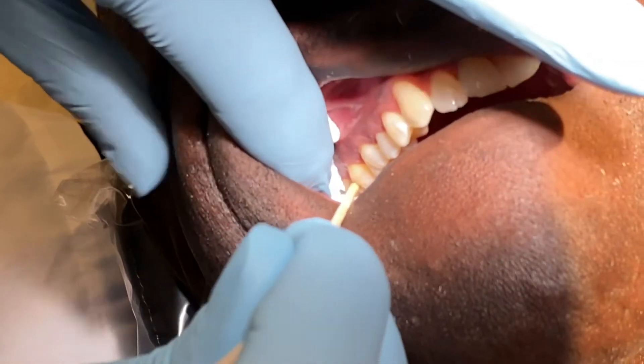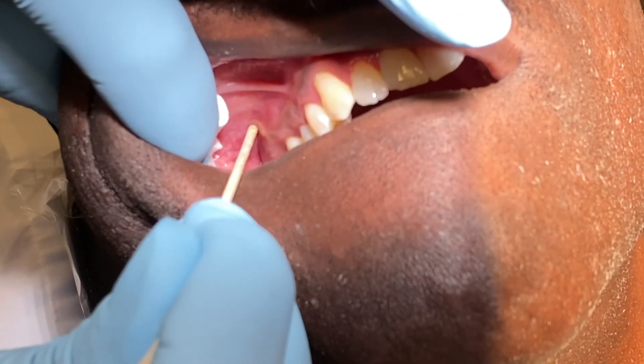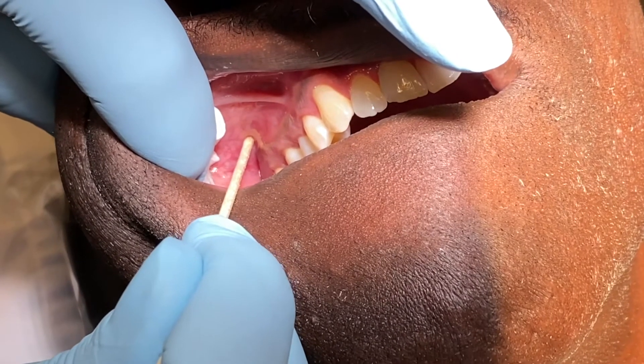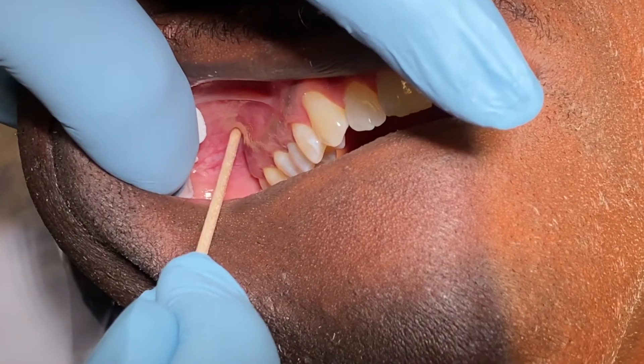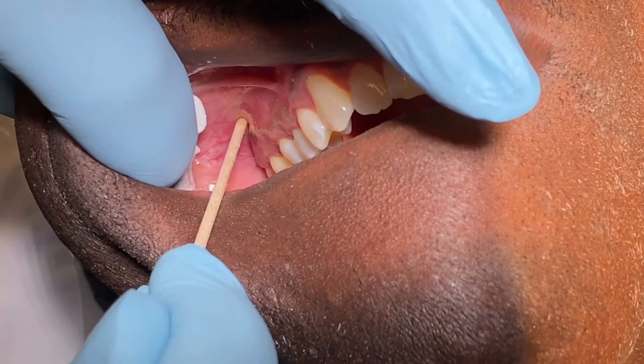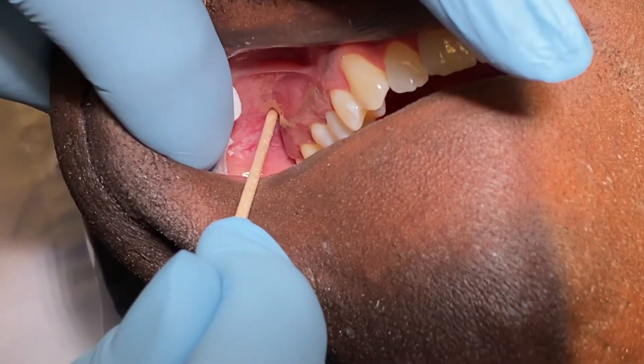This is the second molar, and we're going to go just distal to the second molar in the vestibule in this area here. I'm going to use a 30-gauge short needle and pretty much going to almost bury the needle to the hub.